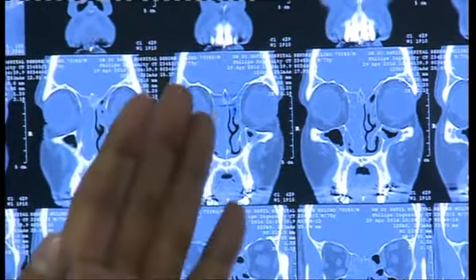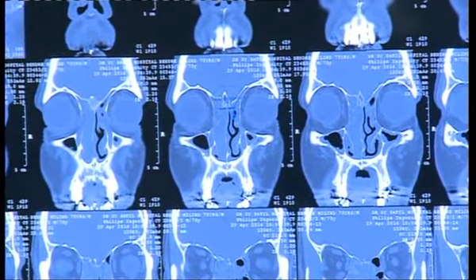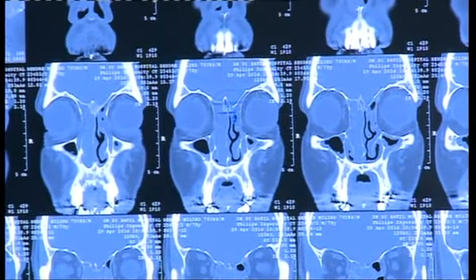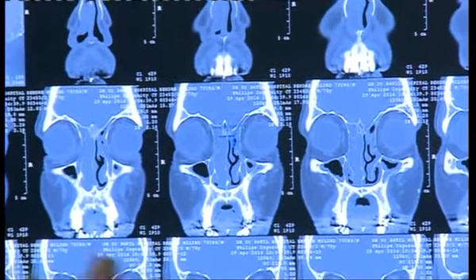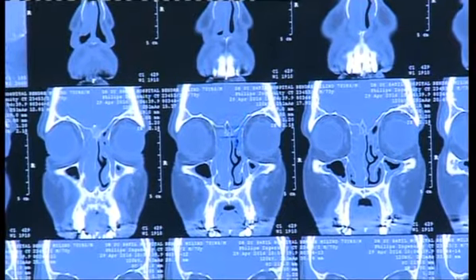I hear this all the time, and honestly, when I'm doing the surgery, I've never even once done something like this. I think this is very, very uncommon. And secondly, because Stammberger drew those three diagrams, I think we are all following it.